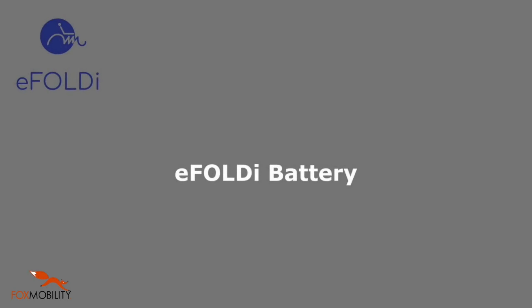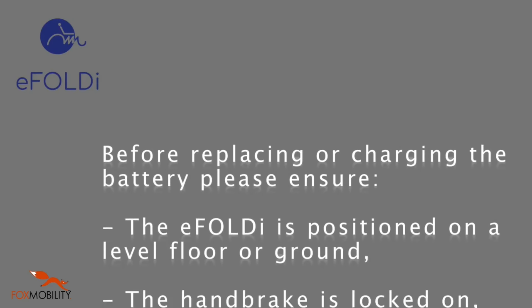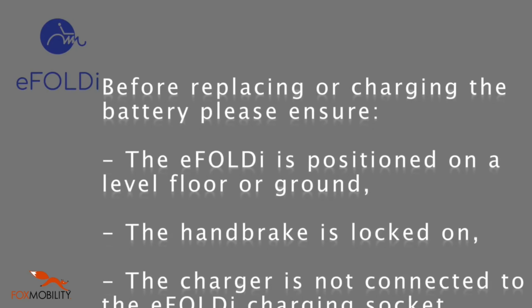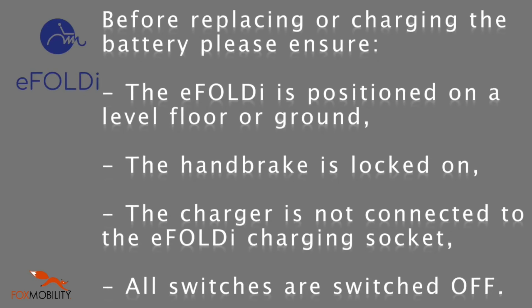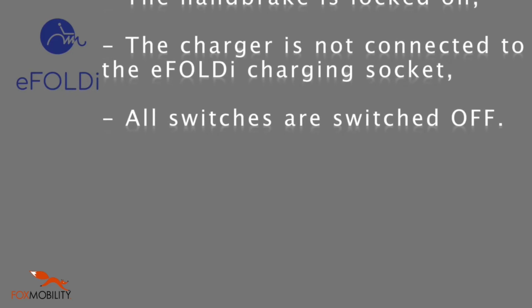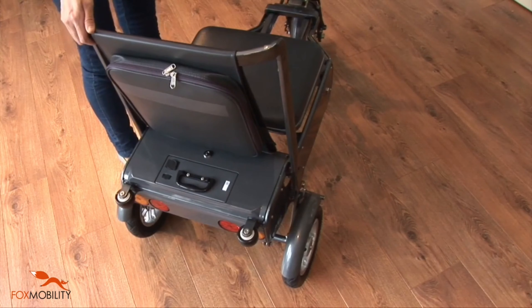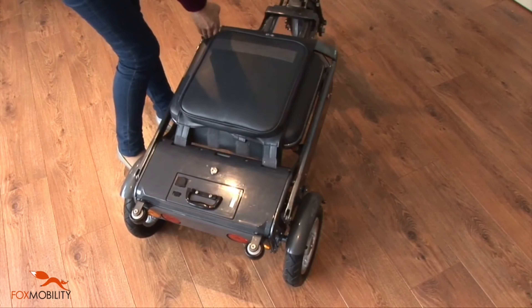Replacing or charging the battery. Before replacing or charging the battery, please ensure the eFoldie is positioned on a level floor or ground, the handbrake is locked on, the charger is not connected to the eFoldie charging socket, and all switches are switched off. The battery pack is at the back of the eFoldie in the control compartment located behind the backrest.